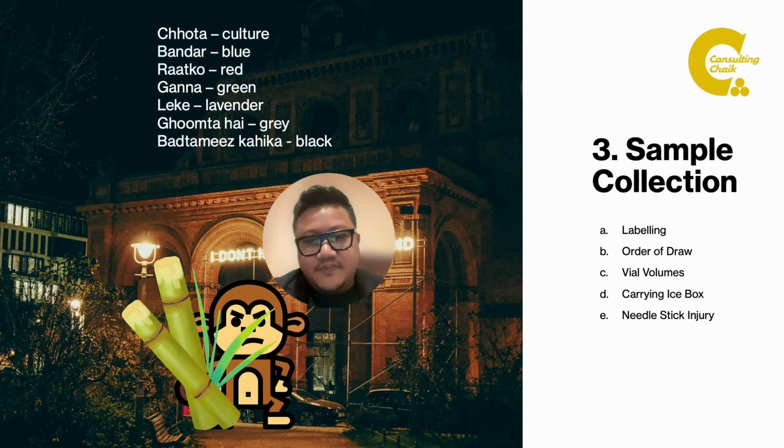And another important aspect is the vial volume. The sample has to be taken as per the mark. Whenever you change the volume of the sample, you actually need to change the vial. If you collect less blood than the mark, then the blood gets concentrated and the reagent inside gets concentrated. And if you take more than the mark, then the reagent gets diluted.